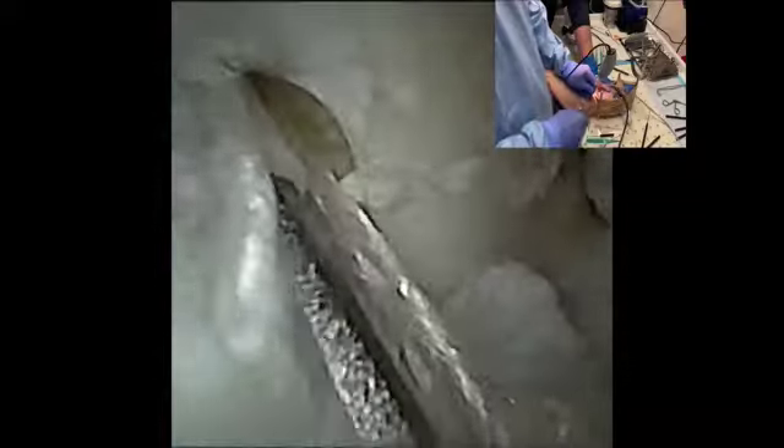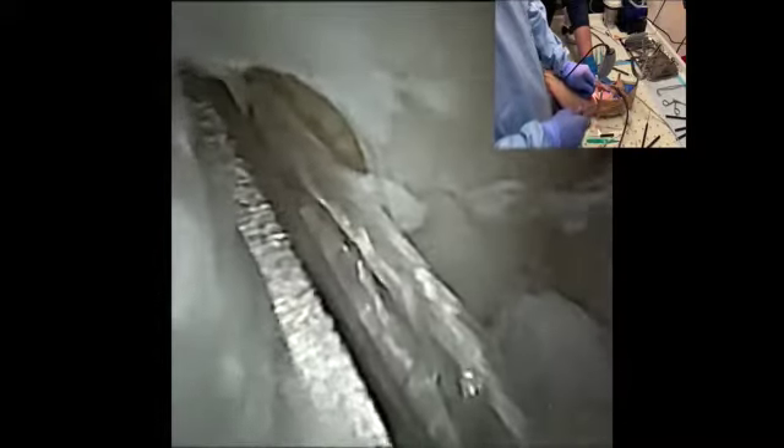Next, a guide pin is placed at the talus insertion. It is then overdrilled to receive the suture anchor. The suture anchor is then seated into place in the talus and malleted until the threads engage the subchondral bone. After insertion, the suture tape can be appreciated here.